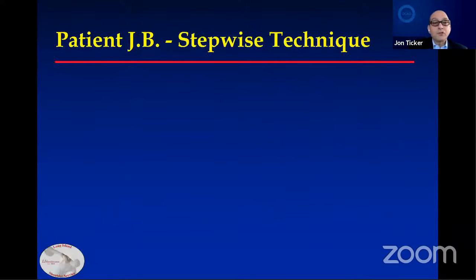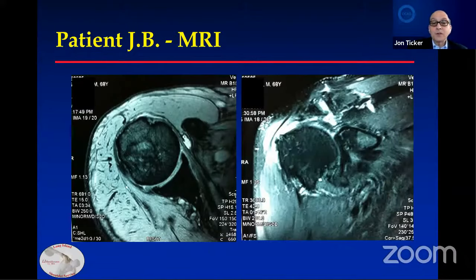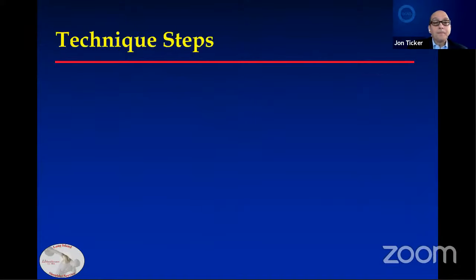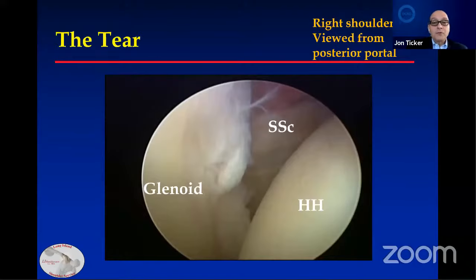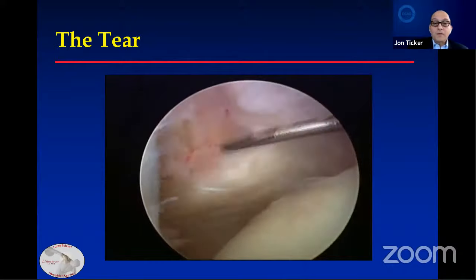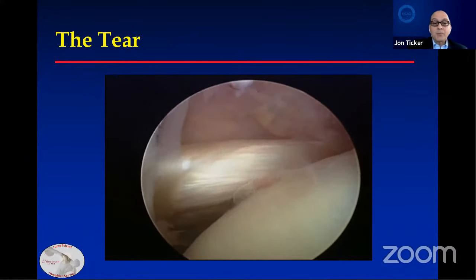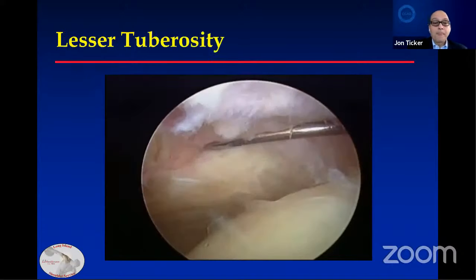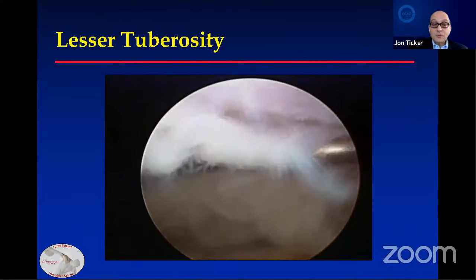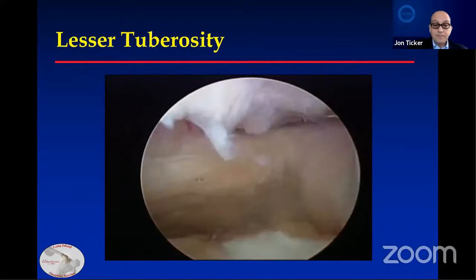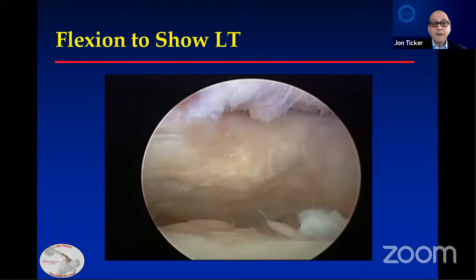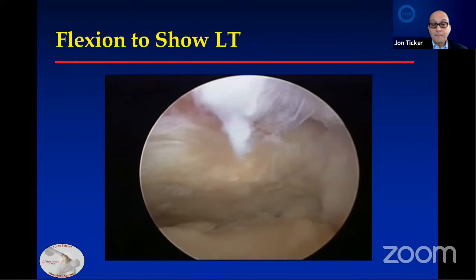I'm going to go through this one patient in a stepwise approach. This MRI shows he's got a subscapularis tear as well as a posterior superior cuff tear. This is a right shoulder viewed from posterior, and as we retract, here's the comma tissue — I'm bringing the tendon laterally. This is how much I'm going to have to repair it onto the lesser tuberosity. There's the middle glenohumeral ligament. You want to expose and visualize the lesser tuberosity. If you can't see it well, simply flex the arm and you can expose it much better. This is a complete 100% tear.